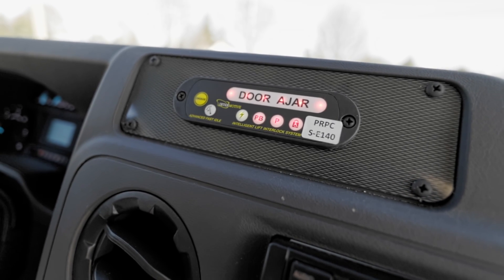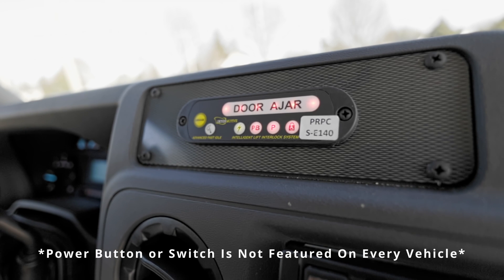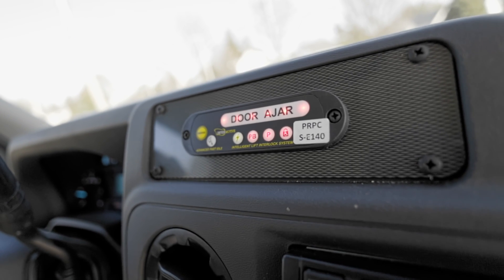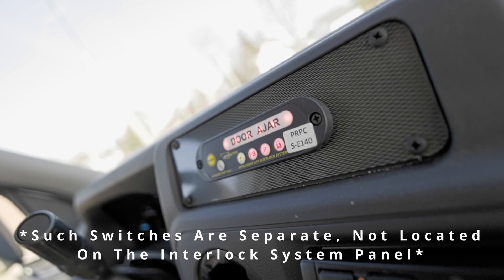Depending on your vehicle, you may have a power button or switch to enable the wheelchair lift's interlock system. If you haven't already, make sure that this button or switch is set to on.